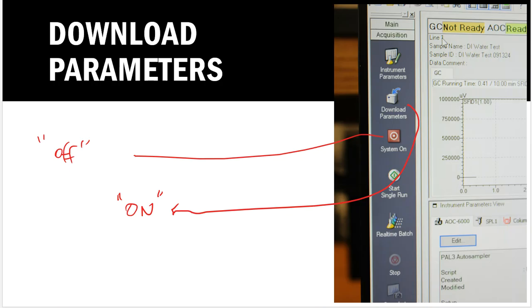And at this point, again, we just turned some on buttons on. We turned on the software. We heard a beep, and it was like, yeah, they can communicate when needed, but that establishment is there. And now by hitting system on, we are establishing that connection, and they are talking to each other finally. And it's also killing two birds with one stone, and it's also sending method parameters over there as well.